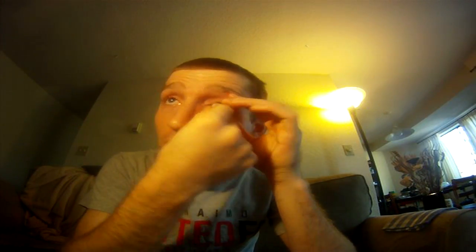Don't like it. I think that when I go swimming, I'll probably wear this. I haven't really gone swimming a whole lot, but my prosthetic eye does come out and it doesn't float. So that kind of sketches me out. And unless I get goggles, I'll probably just pop in my conformer when I go swimming. But yeah, that's it. It gets a little bit of movement, and depth perception's alright, getting better, I guess. And yeah, this is my conformer.